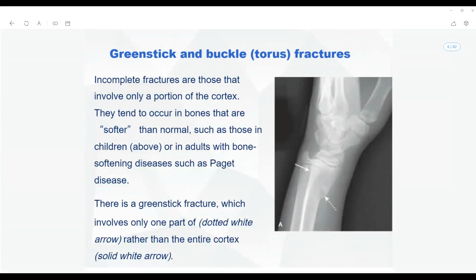Who can tell me the scientific names of all your fingers? Phalanges. Really? First phalanx, second phalanx, third phalanx, fourth phalanx, fifth phalanx? That's what it is? There are some names to that. Okay, try to look at this x-ray and tell me where the fracture is.